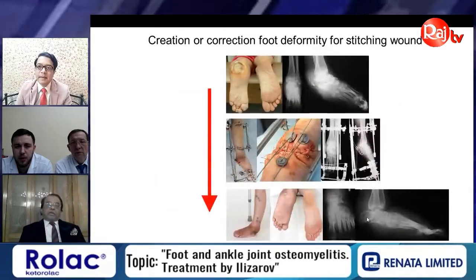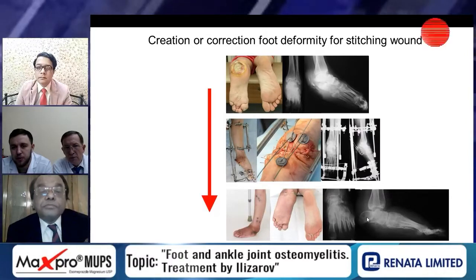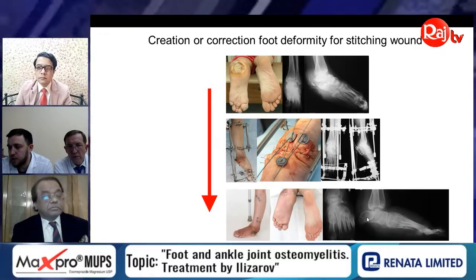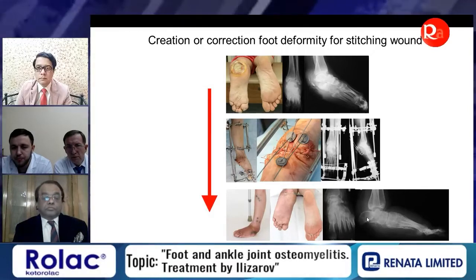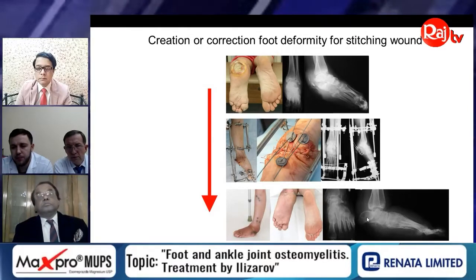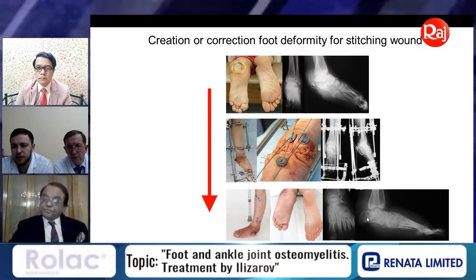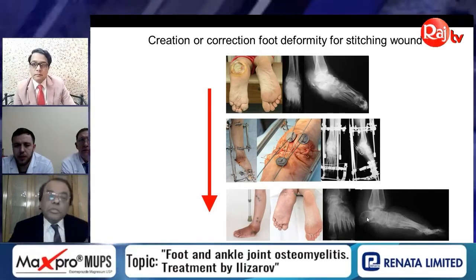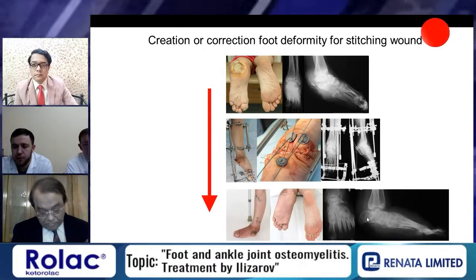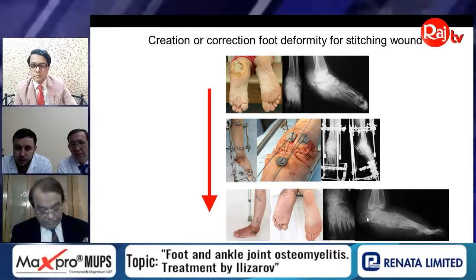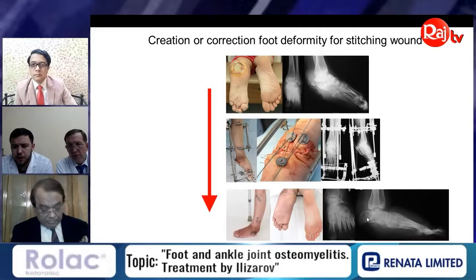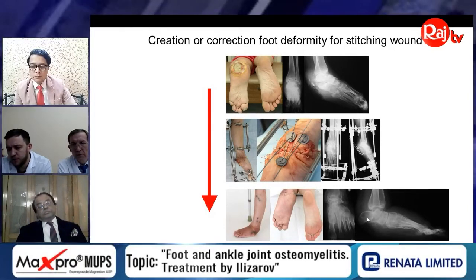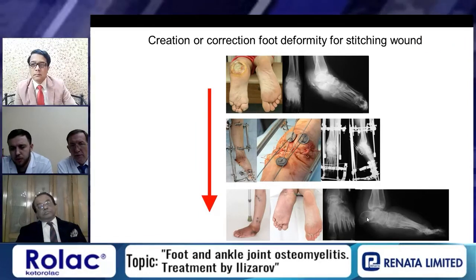After correction, total fixation in the Ilizarov frame was two and a half months. After treatment the patient does not have recurrence of the wound on the plantar surface. Another technique: when the wound is located on the hind foot, we fix the foot in the external fixator in equinus position, which creates good conditions for healing, and after wound healing — usually 20 to 25 days — we gradually correct the foot to normal position.